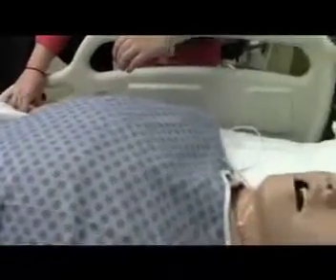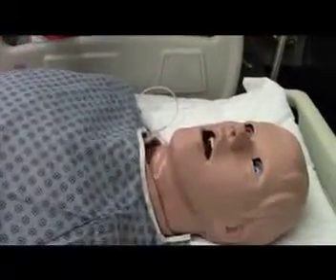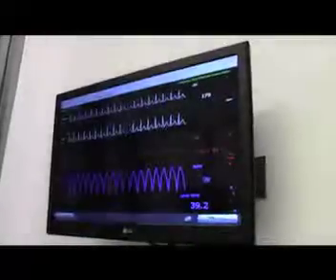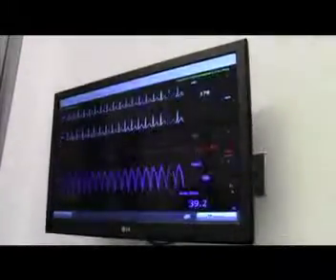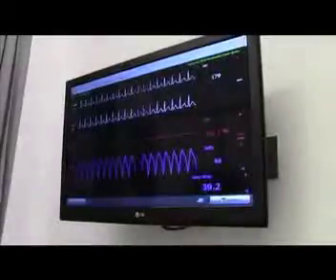Pretty unique. We're one of the only colleges of pharmacy in the country to have this extensive simulation center. We were actually one of the very first pharmacy colleges in the country to even get a simulator. This is back in 2001. We're well known for that in terms of the national stage, and so that's certainly something the university has capitalized on.